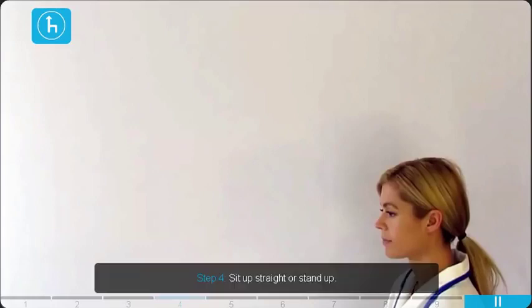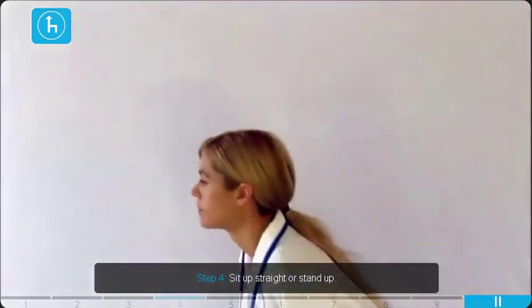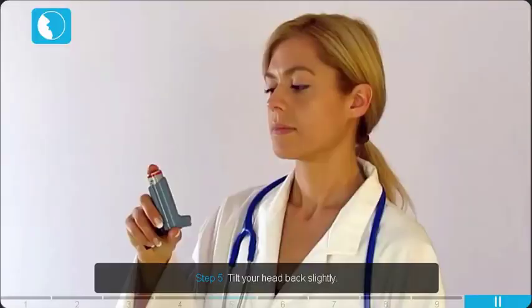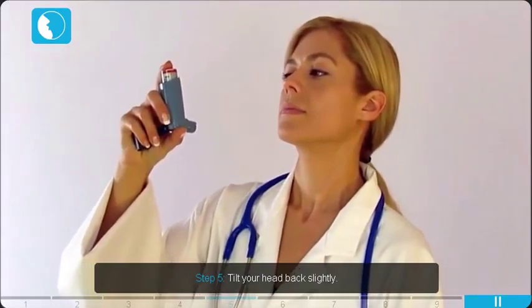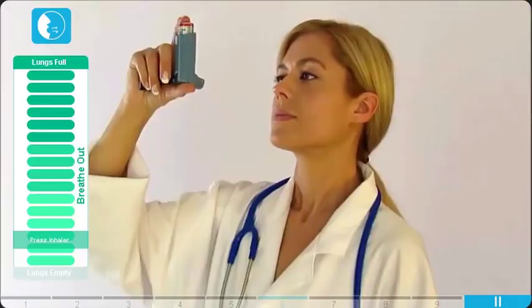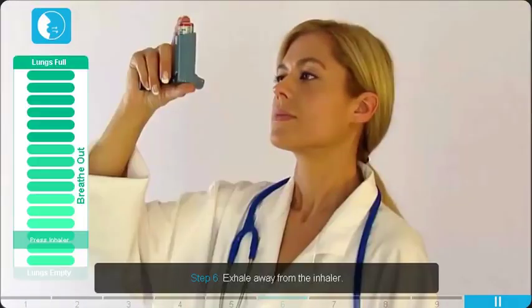Sit up straight or stand up. Tilt your head back slightly. Exhale away from the inhaler.